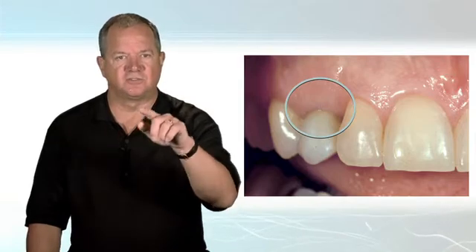So there's our problem. What we need to do is we need to create tissue contour, and we don't do it typically with surgery. We don't try and do it with a laser or blade.